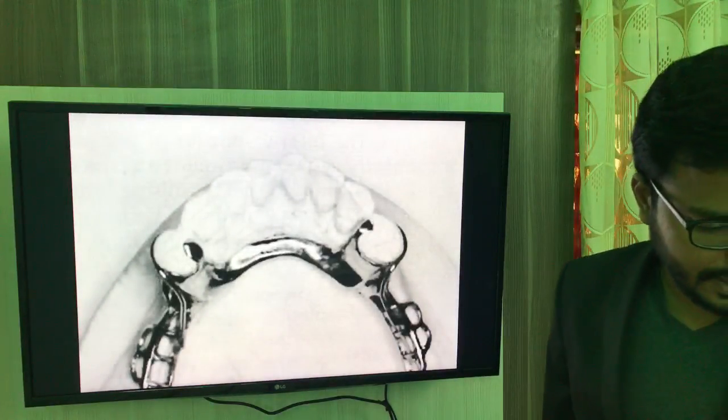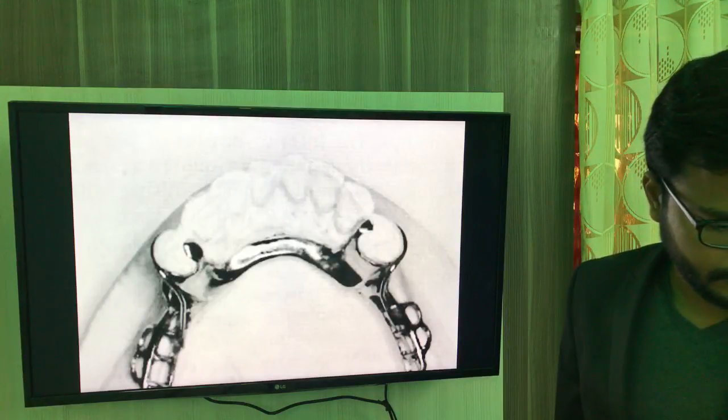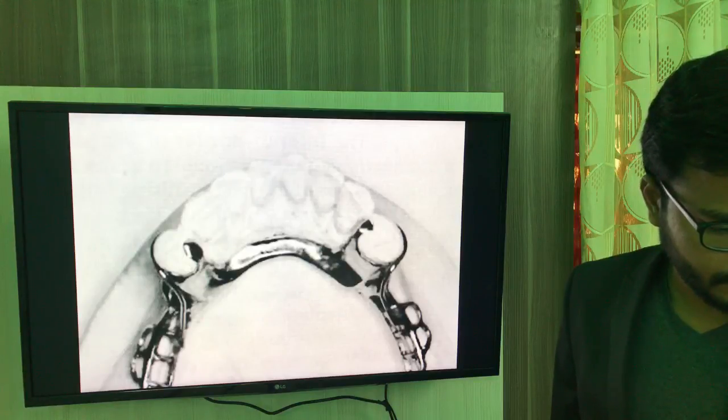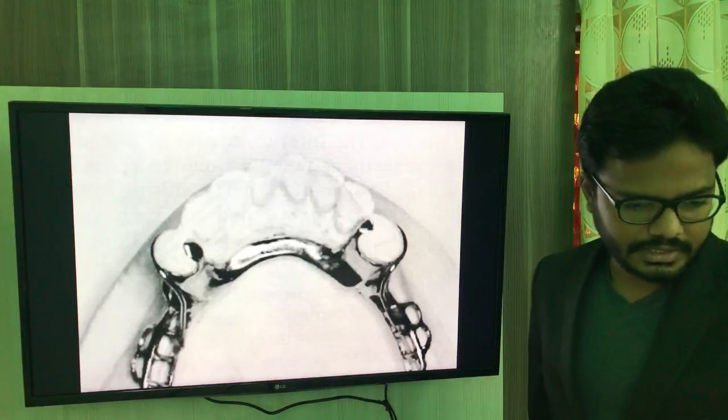And what does this image represent? Let me just tell you whether it is a lingual bar or sublingual bar. So it's obviously a mandibular major connector. So what does this represent?